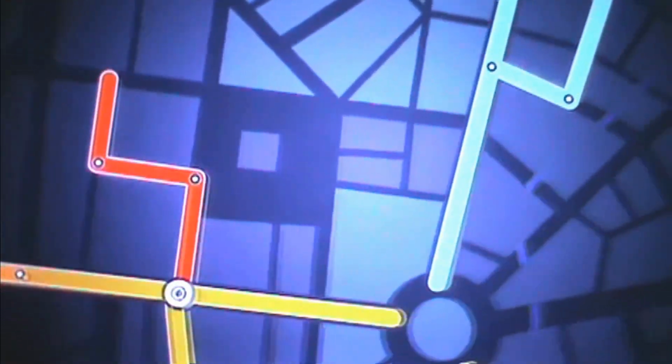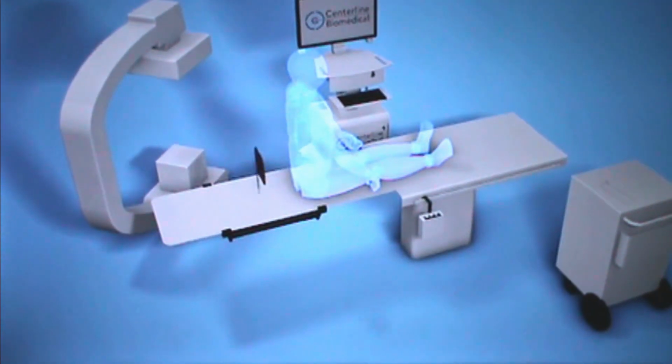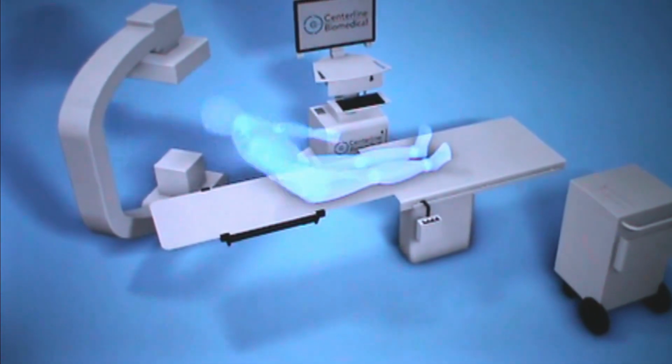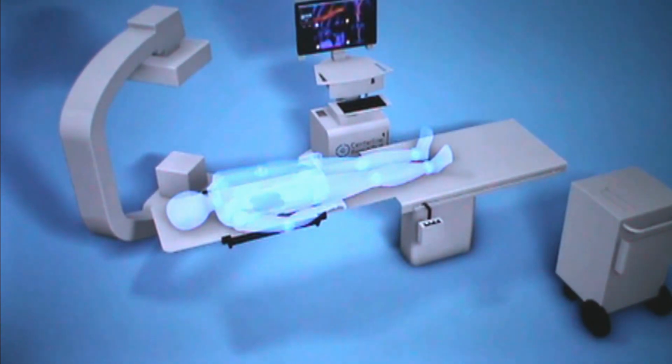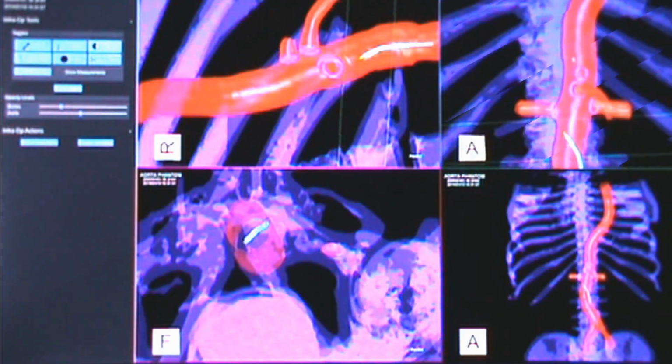When we process the signals that come through there, we can figure out exactly where the patient is because we put a tracking marker on them. We can figure out exactly where all our tools are. And then we combine that with our special 3D modeling algorithms to provide the navigation.